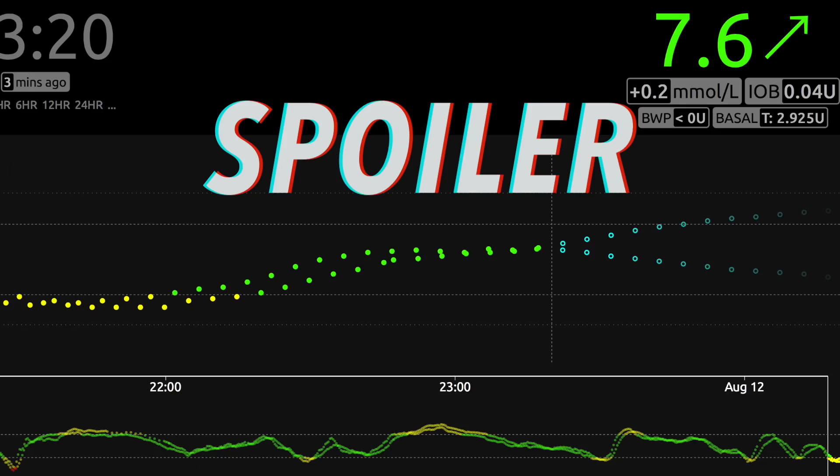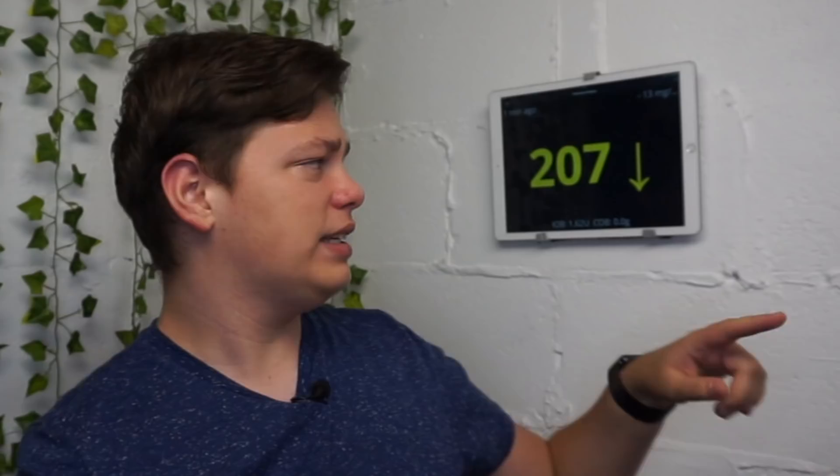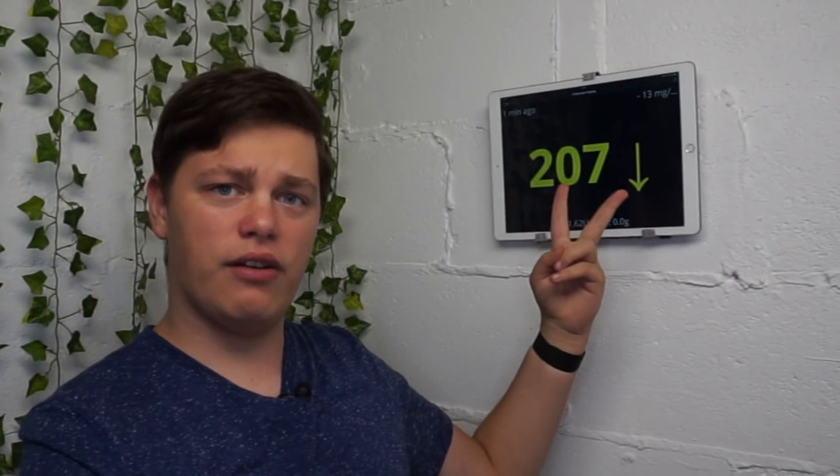In case you don't know, I don't usually wear two CGMs — I'm just comparing the G6 accuracy with the Libre, and I'll do a video about it at some point. This light blue glucose level is an average of both, in case you are interested.